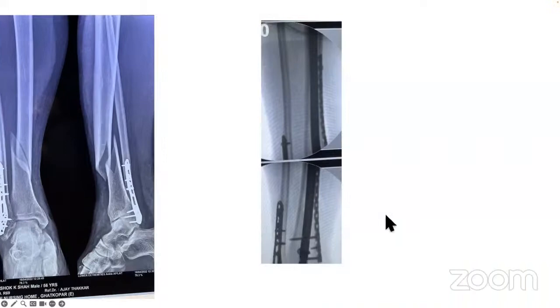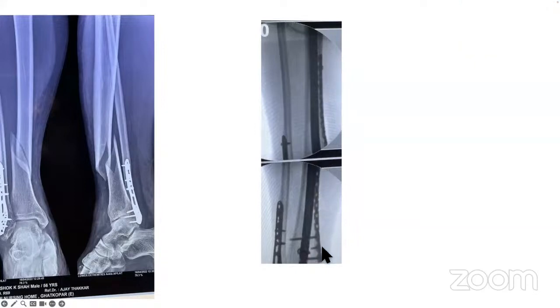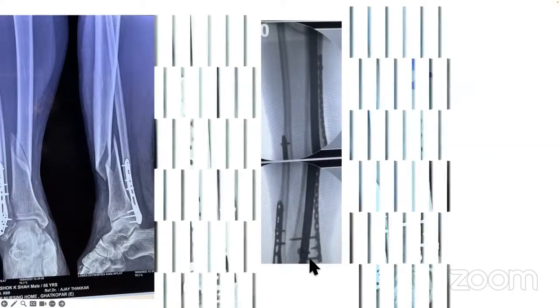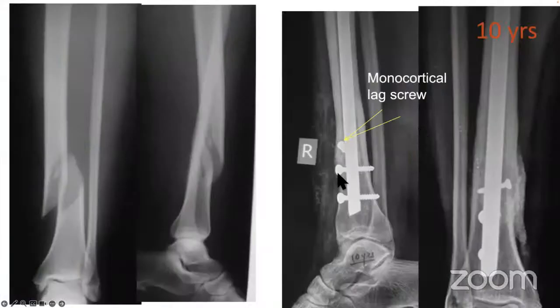And once you put it in, and if you have a doubt, like as I said, on day one, I put in this thin plate. Again, the patient walks in. Here, there were 3 screws distally. Here, you can see it here. But still, I put in the plate. You can see 1, 2, and 3 screws were there. But I put in a plate. Patient is walking about, moving about on day one, and the fracture heals up.